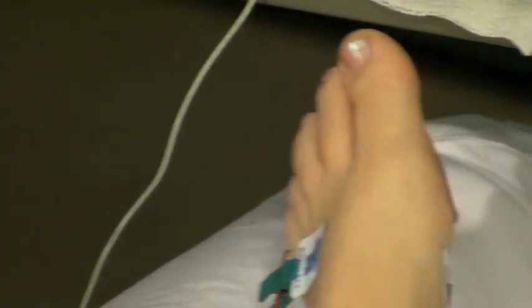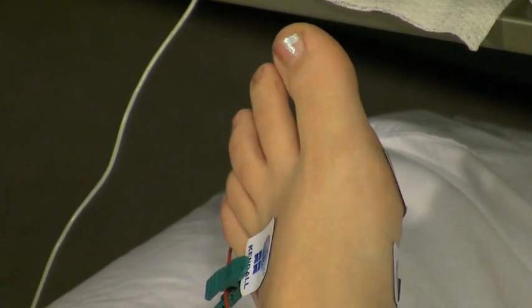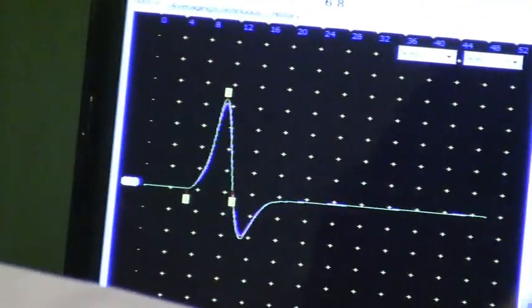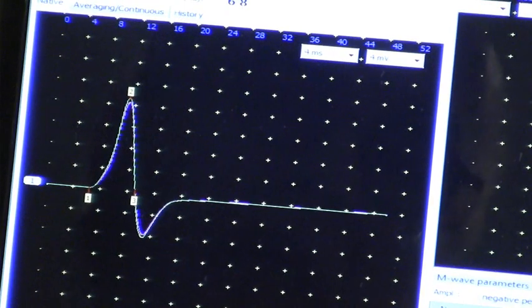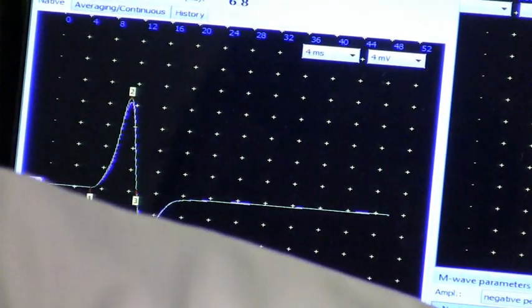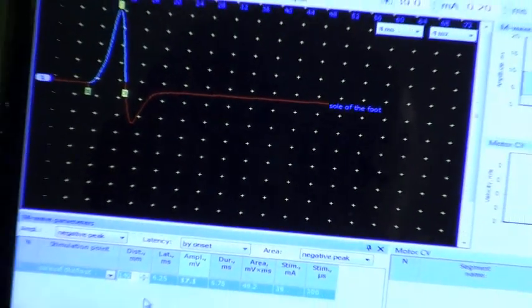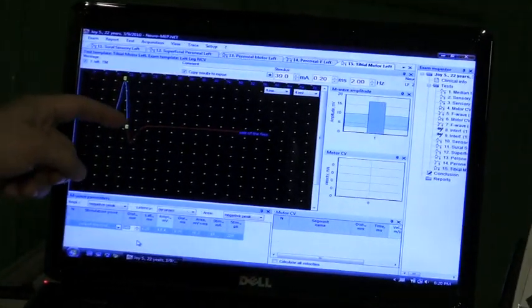That's the response — a nice response. Still growing. Not growing anymore. And that's the posterior tibial nerve motor response. I look at it and it's giving me all of this information: the latency, the amplitude, and the duration.